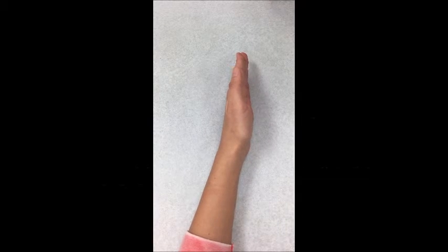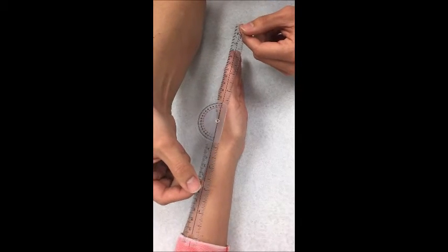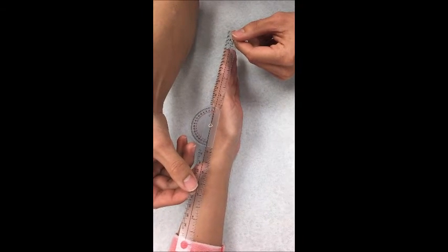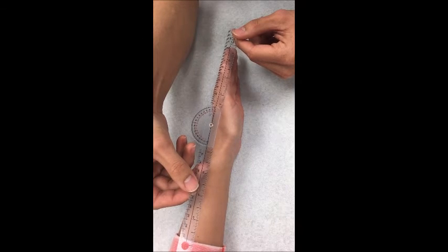The client is seated with the forearm at 0 degrees mid-position, the wrist at 0 degrees, and the forearm and hand resting on the ulnar border. The axis of the goniometer is at the junction of the thumb and the index finger metacarpals. The stationary bar is over the radius, and the movable bar is parallel to the thumb and index finger metacarpals.